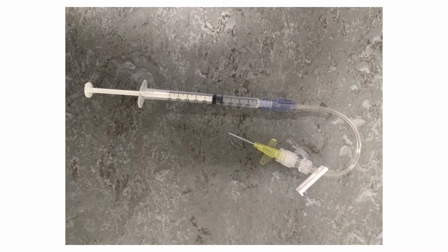So it's really important you know your dead space, and actually you'd be surprised how long it can take for your infusion to get through that dead space. So for example, let's take a 3 kilo baby, and as I said, the starting dose of adrenaline is 0.3 times the weight in kilos, and that's in mLs an hour of that standard 1 milligram in 50 mLs infusion. So with that 3 kilo baby, 0.3 times 3 is 0.9 mLs an hour. We've got 0.4 mLs of dead space to get through. That's going to take 27 minutes from when you start the infusion to when the adrenaline first reaches your patient. So you have to know that.